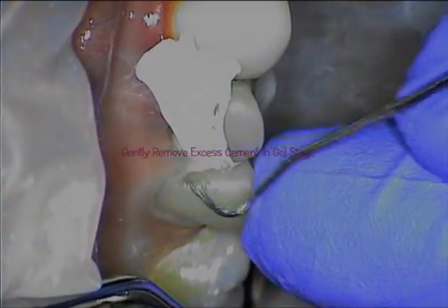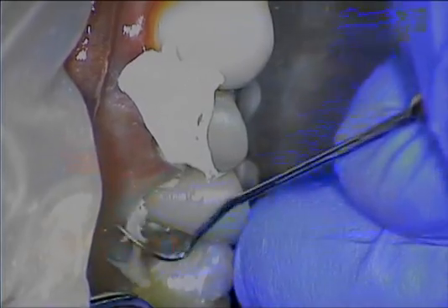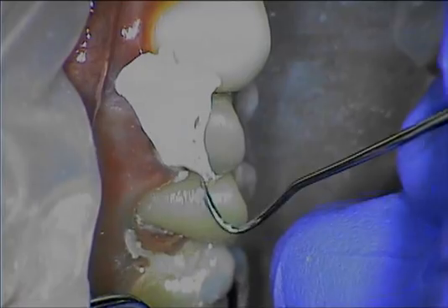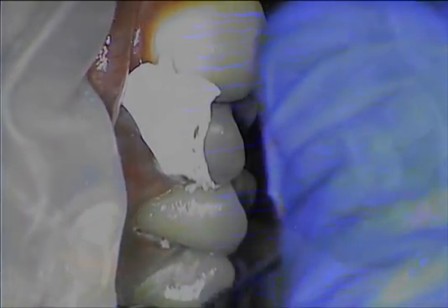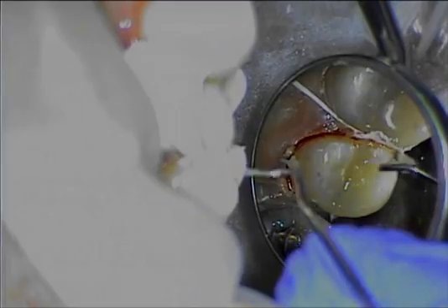At this point in time, the Resoment is very easily removed in what I'd like to call a gel state. There's plenty of working time — I believe you have up to two minutes of working time before the auto-cure portion completely activates. You can see how easily that excess cement is removed.